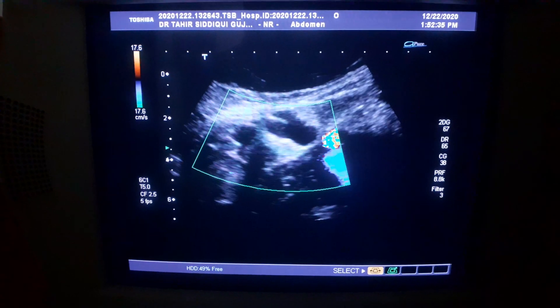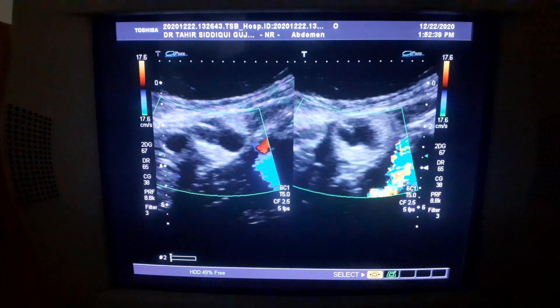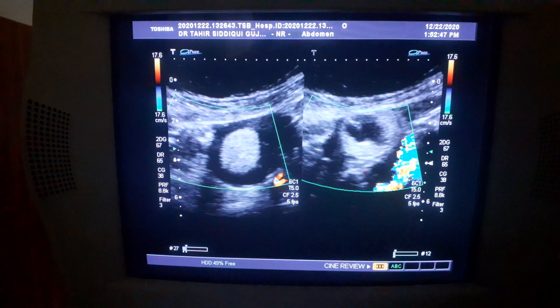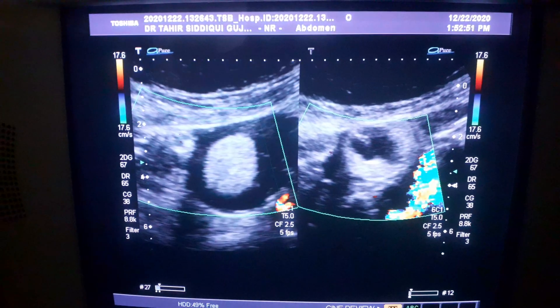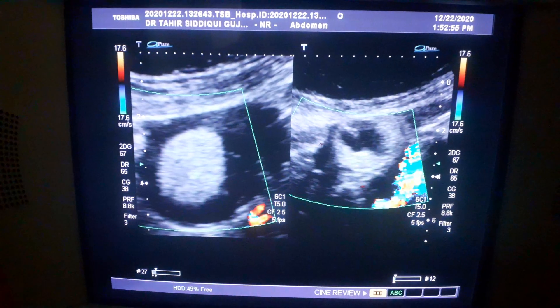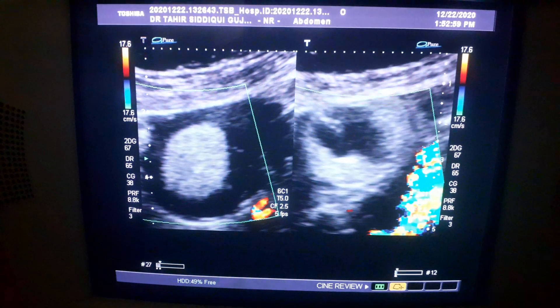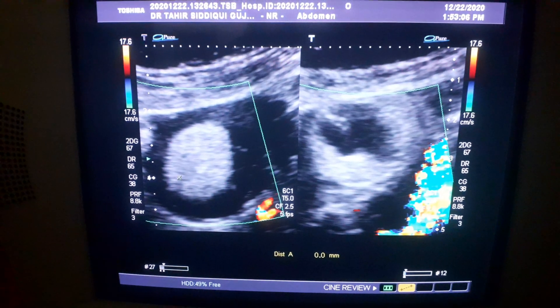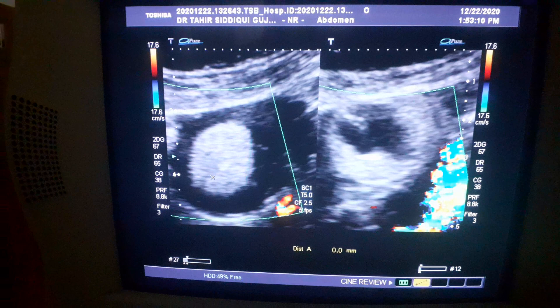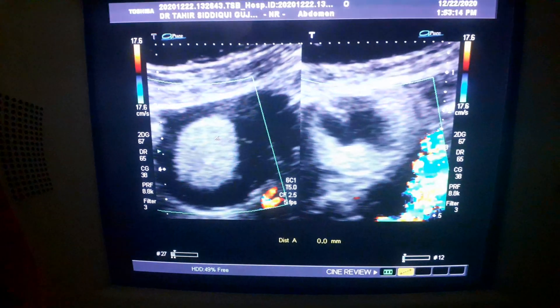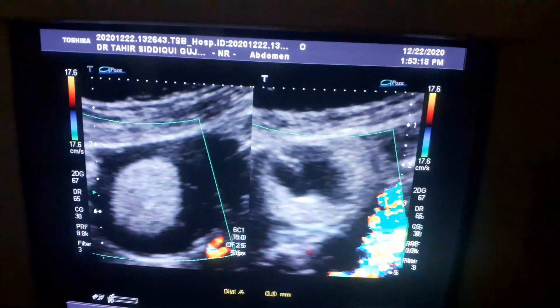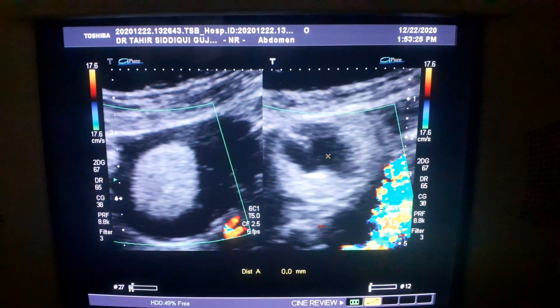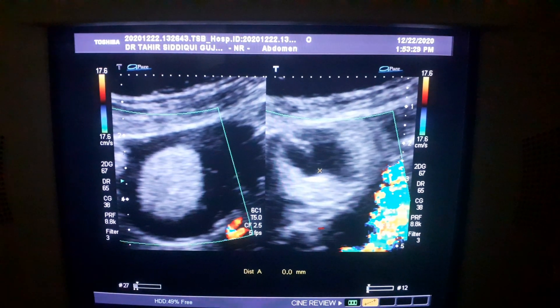This is echogenic area number one, and this is echogenic area number two. This is in fact a case of a dermoid cyst in the region of the right adnexa. This is one cyst — I have taken both sides of the screen just to show you the lateral ball-like echogenic area placed laterally within the fluid-filled cyst, and this is the second one with an internal cystic area, irregularly outlined, with a small amount of debris seen within it.